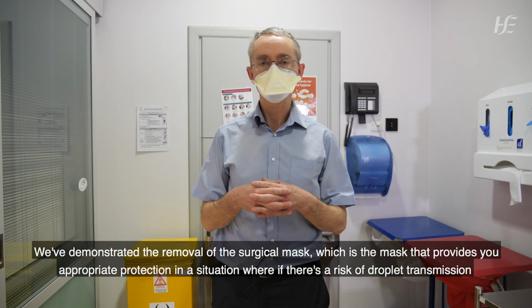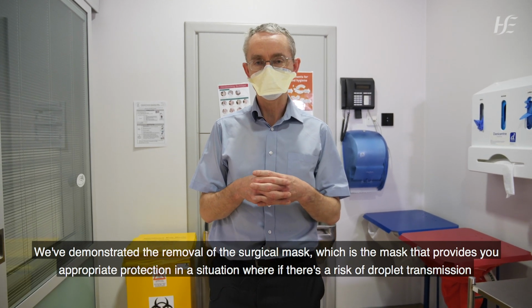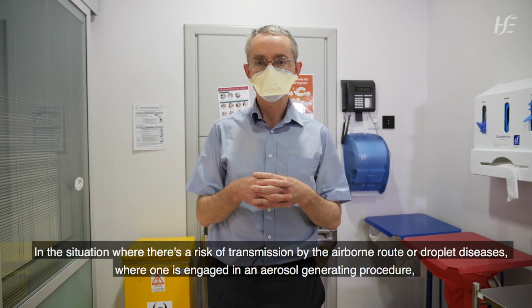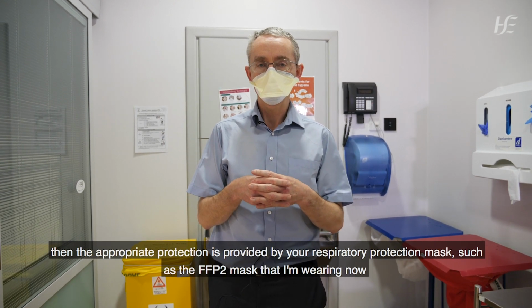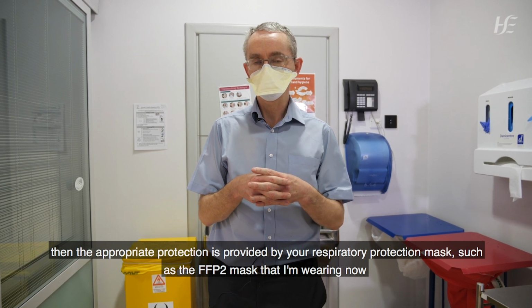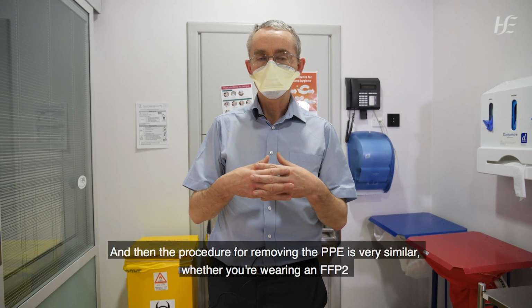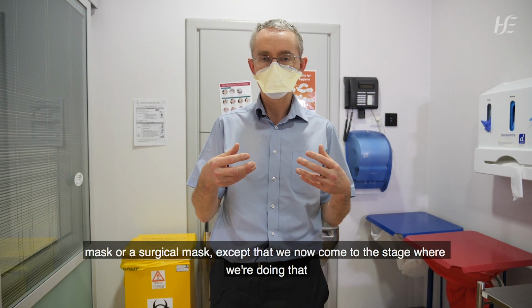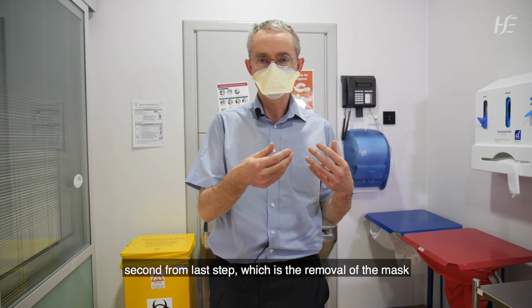So we've demonstrated the removal of the surgical mask, which is the mask that provides you appropriate protection in a situation where there's a risk of droplet transmission. In a situation where there's a risk of transmission by the airborne route, or droplet diseases where one is engaged in an aerosol generating procedure, then the appropriate protection is provided by a respiratory protection mask such as the FFP2 mask that I'm wearing now. And then the procedure for removing the PPE is very similar whether you're wearing an FFP2 mask or a surgical mask, except that we now come to the second from last step, which is the removal of the mask.